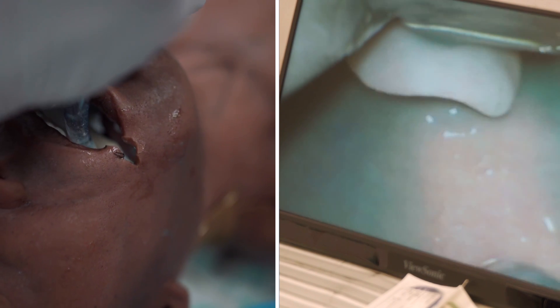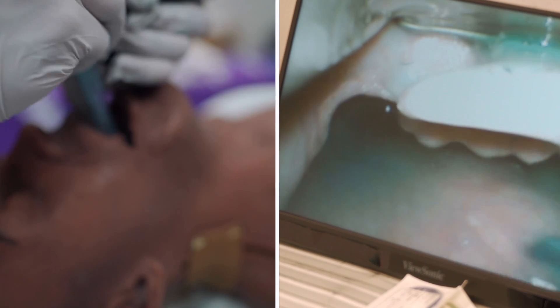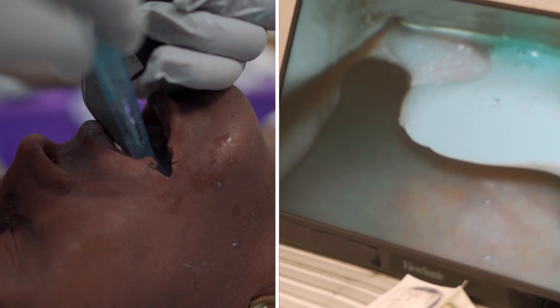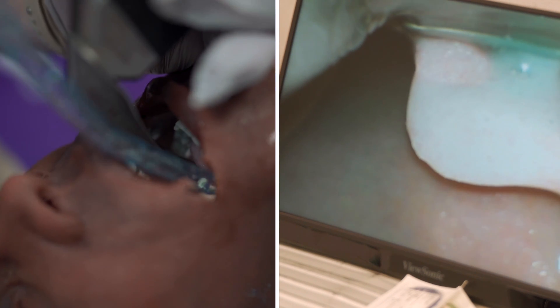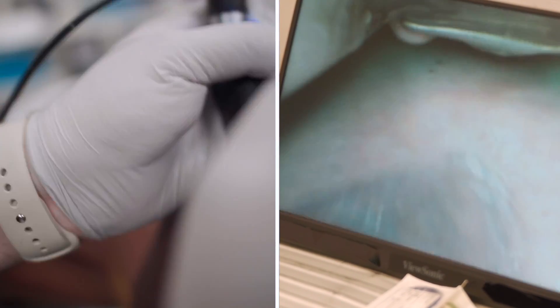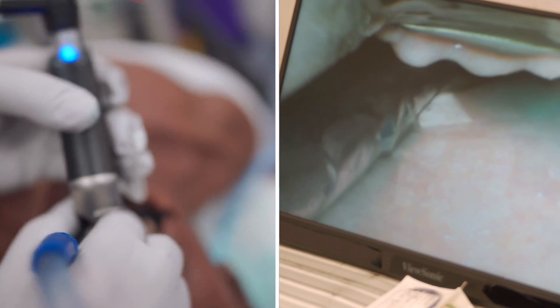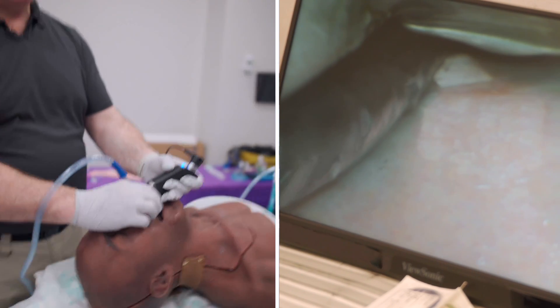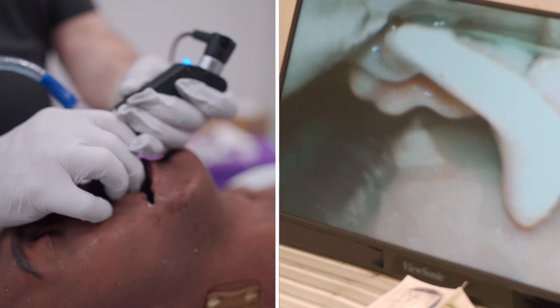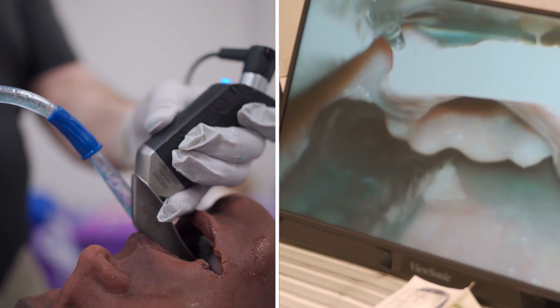I've visualized the epiglottis and the vallecula and I'm going to visualize the larynx now. Because I'm unable to leave the suction catheter on the right side of the mouth during intubation — it will physically obstruct the path of tracheal tube delivery — I'm going to take the suction catheter out and place it down the left side of the video laryngoscope and into the upper esophagus. This is called the SALAD park maneuver. My laryngoscope blade has slid in a little too deep, so I'm going to perform a micro skill of laryngoscopy where I pinch the laryngoscope blade with my right hand and reposition it, achieving a great view for intubation.